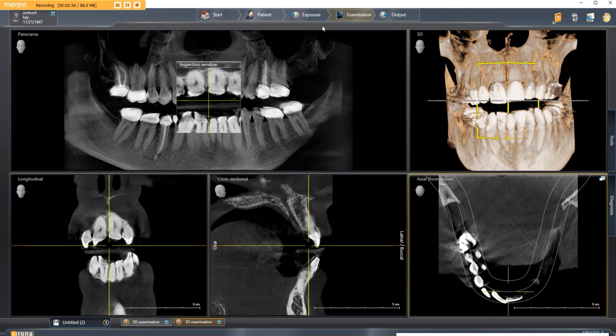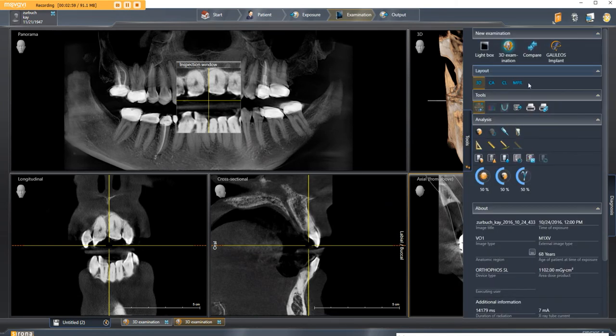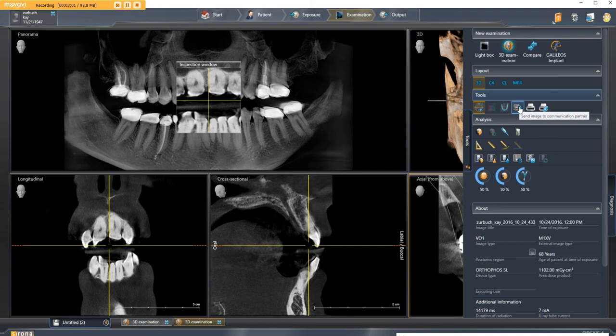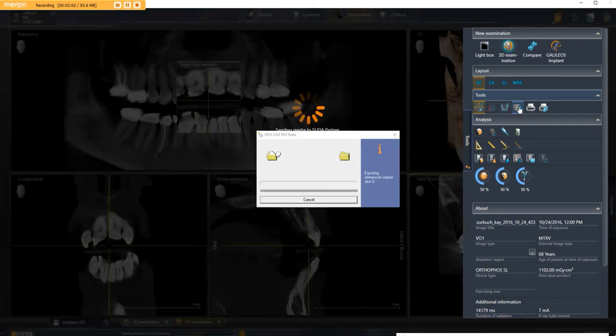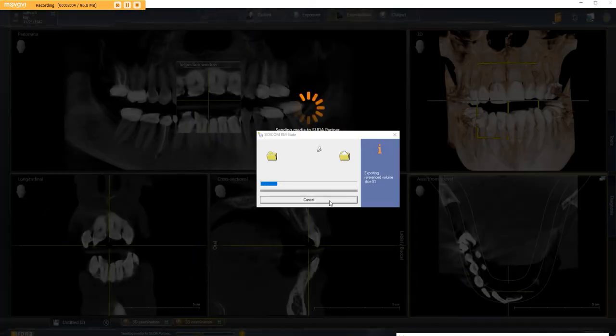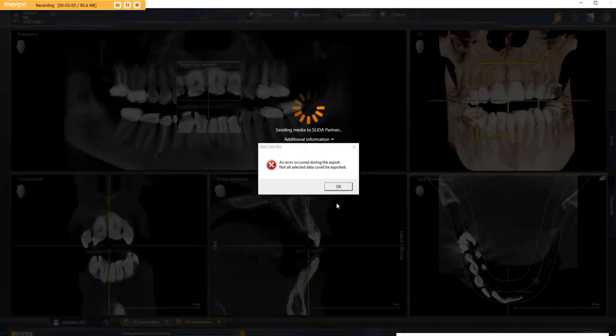And then when you pull up your 3D, you go to tools, you click the button here for export, and voila, it starts exporting. I'm going to hit cancel.